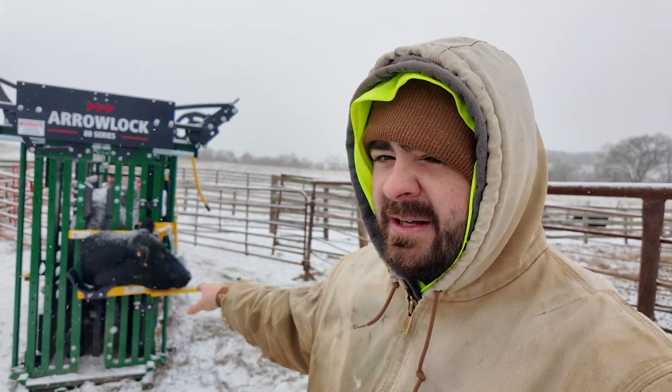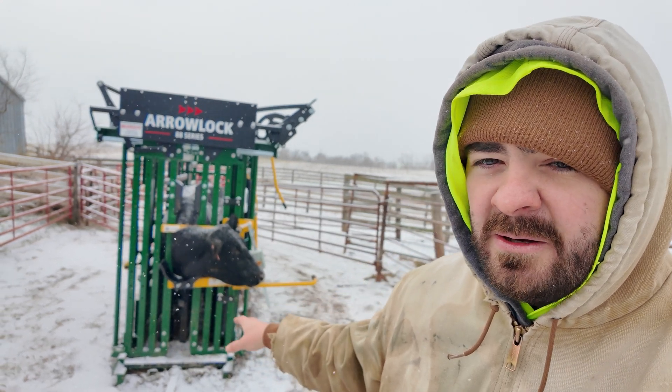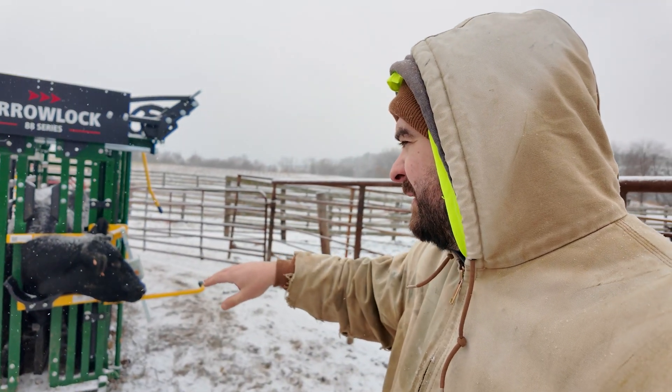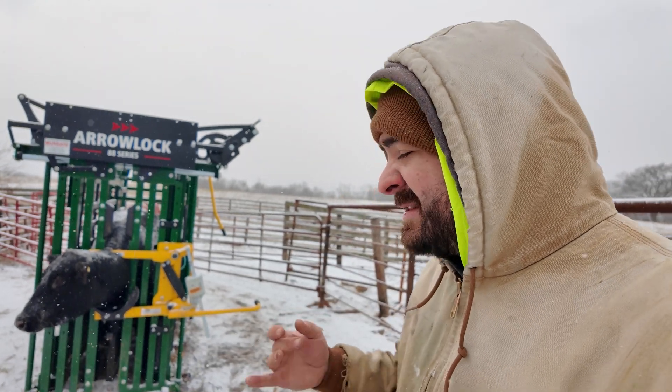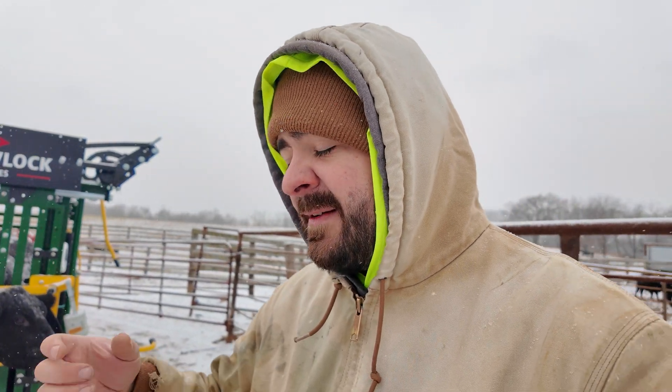We've got number 23 in the chute today — she's one of our calmer cows. We're going to be pulling a blood sample from the base of the tail, similar to how we did last year. This is going to be a short and sweet video on how to pull a blood sample. What we're pulling is the serum, so there's no anticoagulant in the test tubes. There are different vials for different tests you want to run, and I'm looking at doing a couple of those in the future.